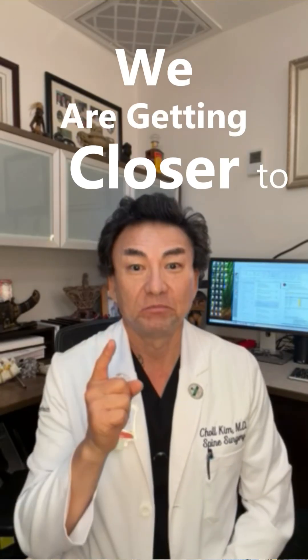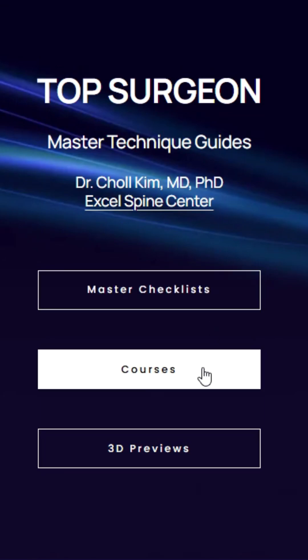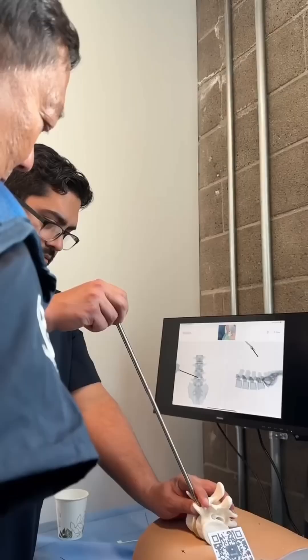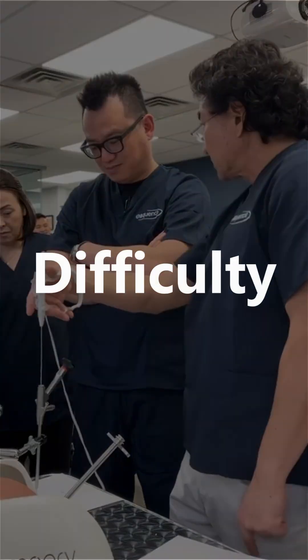We are getting closer to busting the learning curve of endoscopic spine surgery. Check out the TopSurgeon.com Gen 2 biportal technique guide — because the greatest obstacle to adoption of new technologies, especially minimally invasive spine surgery, is the difficulty of getting started.